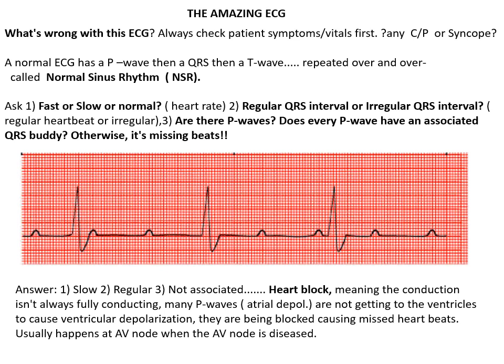Okay, so you can ask, well, where are these QRSs coming from? Well, those are being generated in the ventricles themselves, because the heart has many safety mechanisms if there's a heart block. So say, for example, the atrium isn't delivering the electricity to the ventricles. Well, the ventricles can then generate their own heart rate. Okay, it's typically very slow, but there's a good chance that the patient will survive even with a slow heart rate until they can get a pacemaker.